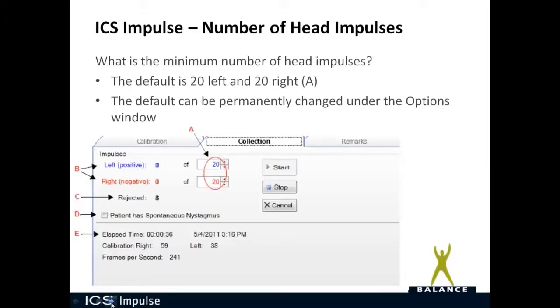Now let's talk about data collection in OtoSuite V. The minimum number of head impulses recommended is 20 to the left and 20 to the right. Once you get better at doing head impulses, you can lower that number — it was recommended by Hamagi and Kurthois as a good starting number. If you want to permanently change that number, go into the Options tab.